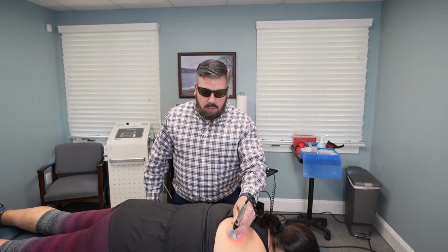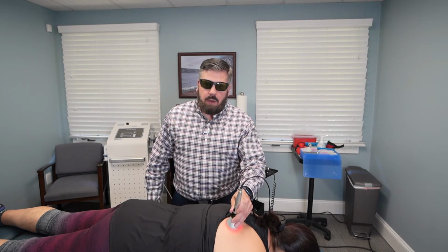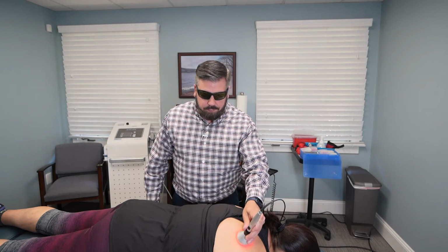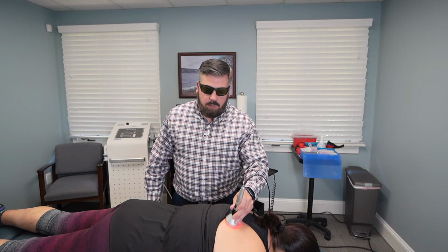A lot of times your primary care doctor will just say, it's going to go away on its own. Well, that could take several months. I've had a patient that lasted for a year, and again, it can be very painful. So depending on the location, this is a great treatment option for you. So basically, we're just going to treat this whole region. And like I said, a typical treatment protocol lasts about 5 to 7 minutes.